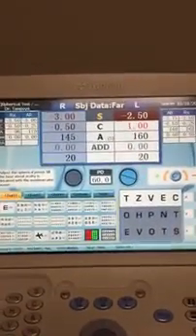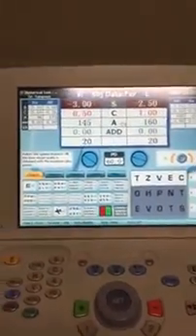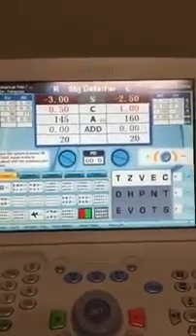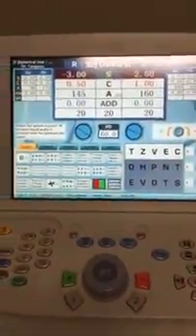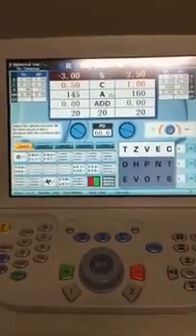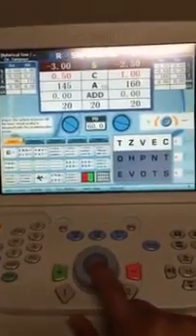You press that button again. You can open up and both eyes are open now. You can check their vision with both eyes, say they can see the 20/20 line, so I will put 20 here. You can see the 20 populates on the screen. So there you go.